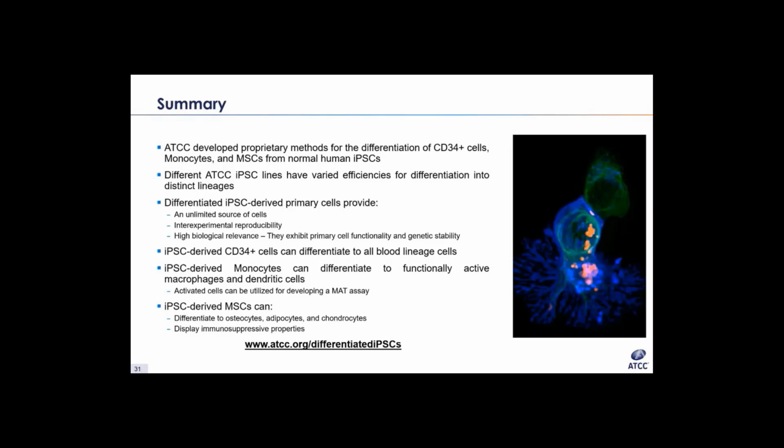So it really depends on whatever kit that you're using, if you're doing a particular cell-based assay, or if you're using a particular differentiation kit. However, for thawing the cells, we recommend using RPMI 1640 medium with 10% FBS for thawing the cells out.